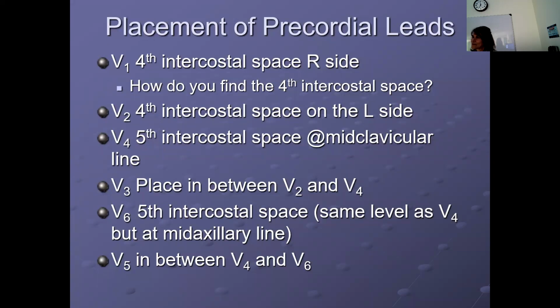Have you ever had an EKG done before? A 12-lead? Have you ever had one of these done before? A lot of people have, and some haven't. I explain where the leads have to go, and ask, are you comfortable with me doing this? Wow, that's a good idea.